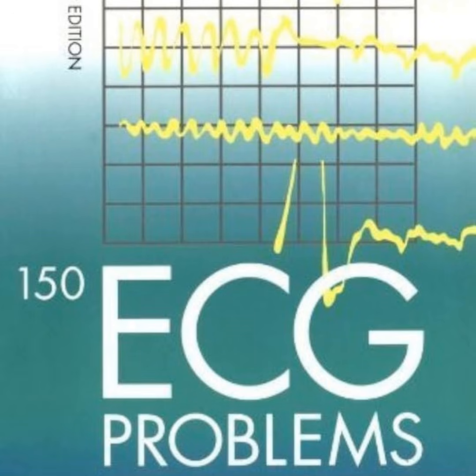But in this patient, V1 shows a dominant positive R wave. The whole electrical vector has completely flipped. The electricity is literally surging toward the right. It's almost as if the right ventricle is, I don't know, a bodybuilder who has been forced to push against a jammed door for years. That's a really good way to picture it.